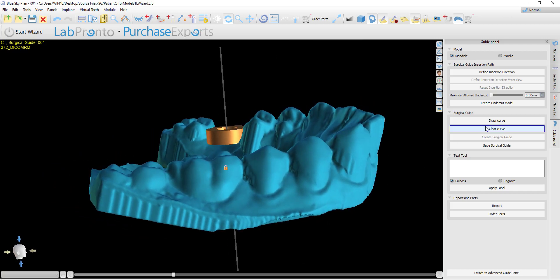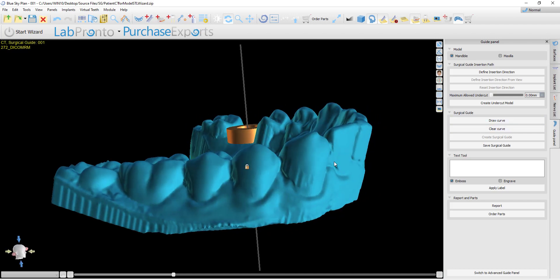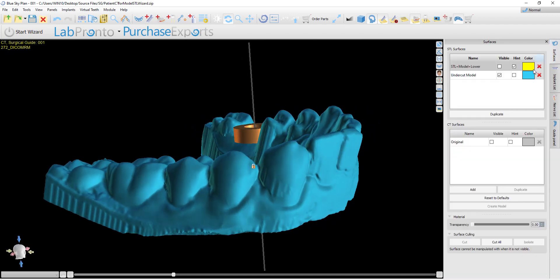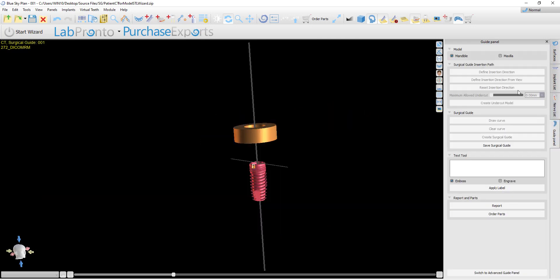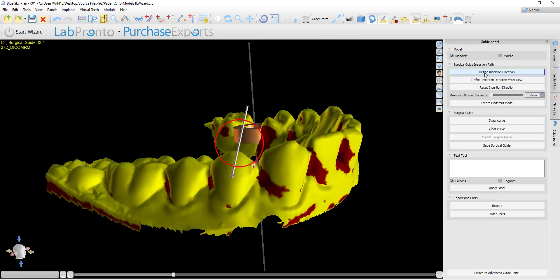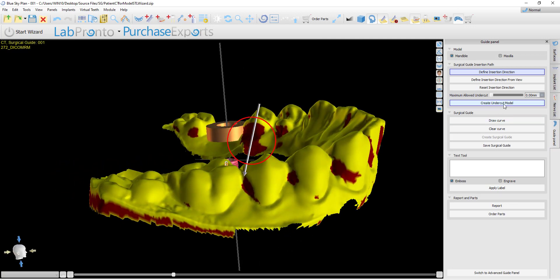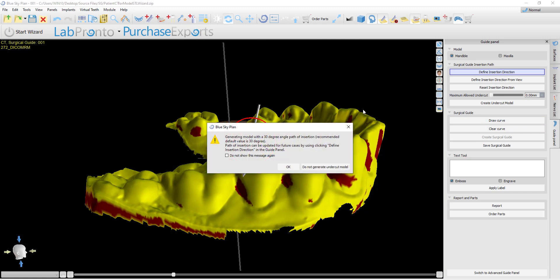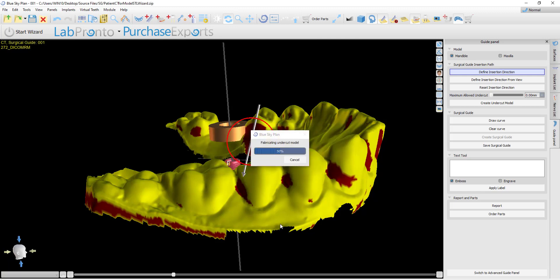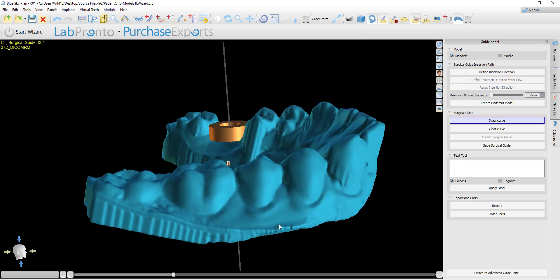The next steps would simply be to draw the curve and create the surgical guide. For clarification, if a user clicks Define Insertion Direction and then does not click Create Undercut Model, but rather proceeds to Draw Curve, we will get the message indicating that the software will automatically generate an undercut model with a 30-degree path of insertion. Clicking OK, the software will automatically generate that model and then the user can go ahead and draw the curve and create the surgical guide.